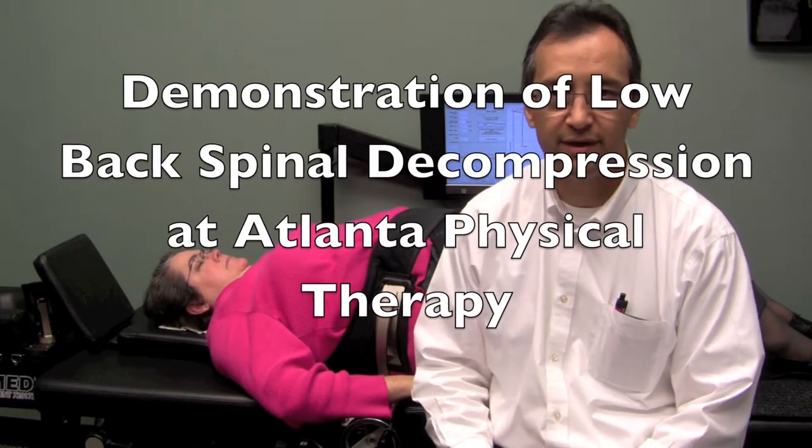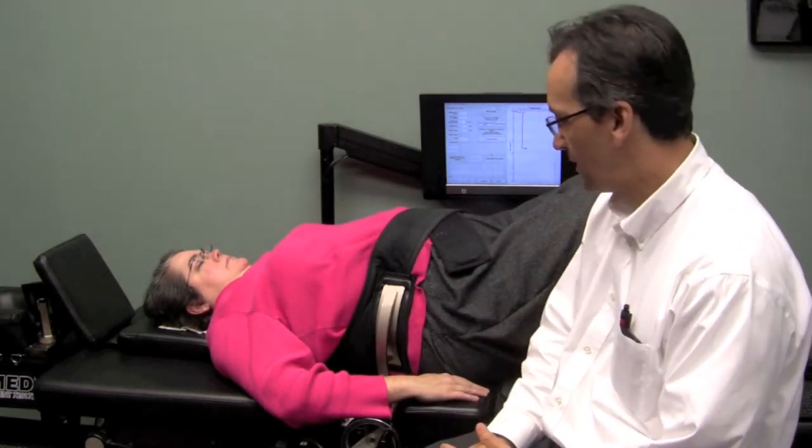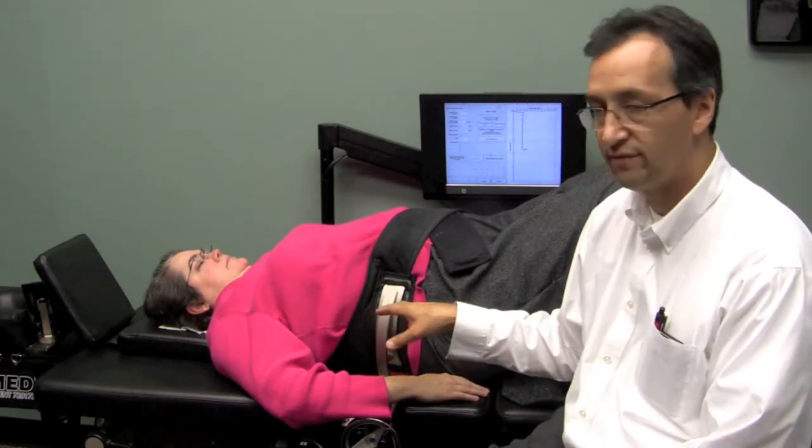I'm Dr. Castanet. I'm going to demonstrate now how the actual spinal decompression table works. I have Mary Ann on the table — she's going to be our model. I have her situated on the table for treatment of the low back.